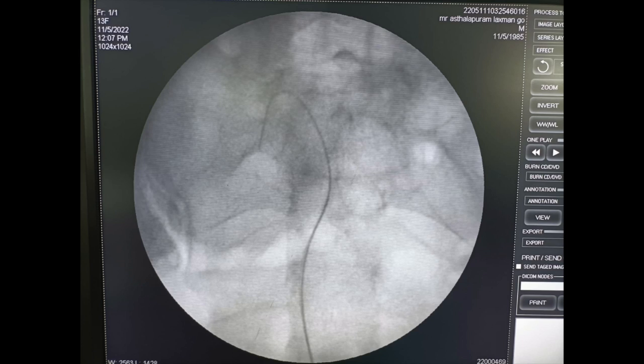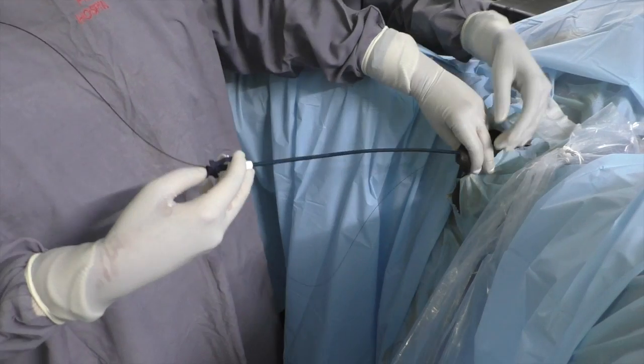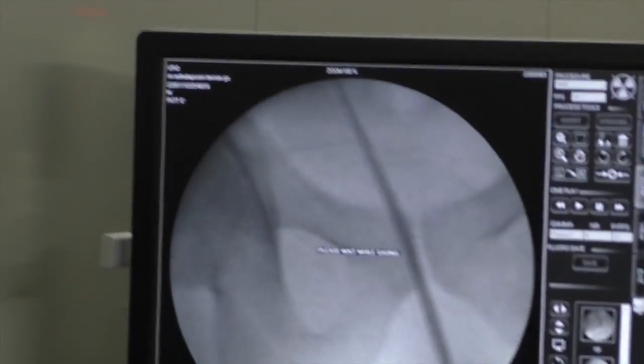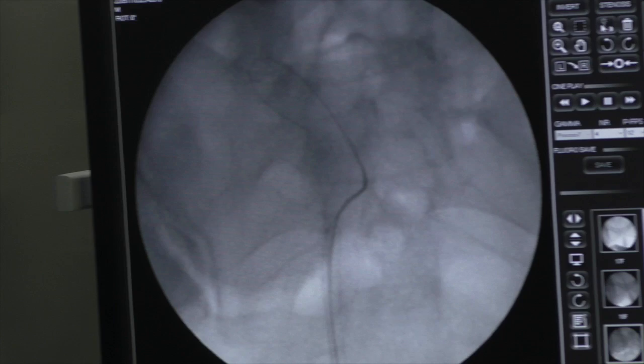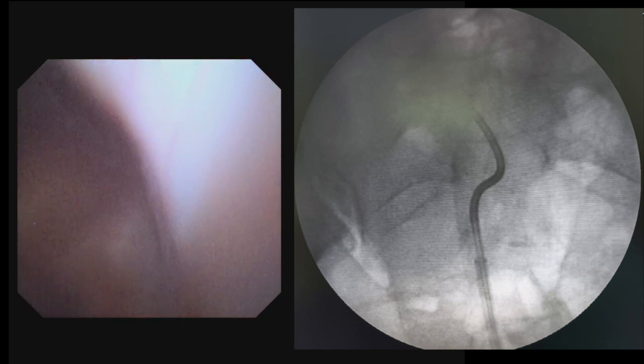After removing the stent, ureteroscopy was done. A 0.032 inch Terumo guide wire was passed and a 10 by 12 French access sheath Cook Flexor was inserted over the guide wire under fluoroscopic guidance. Next, flexible ureteroscopy was done using a disposable digital flexible ureteroscope with 7.5 French outer shaft diameter, with an endoscope sleeve used.